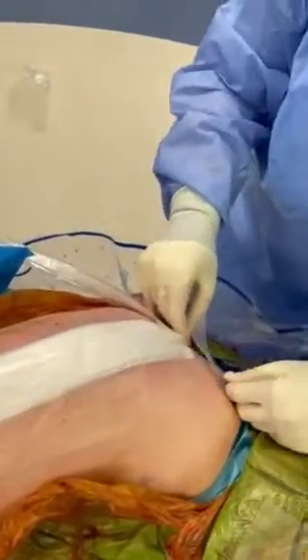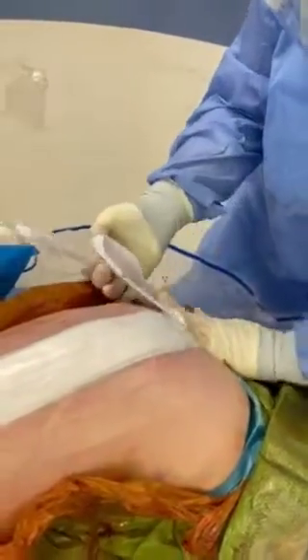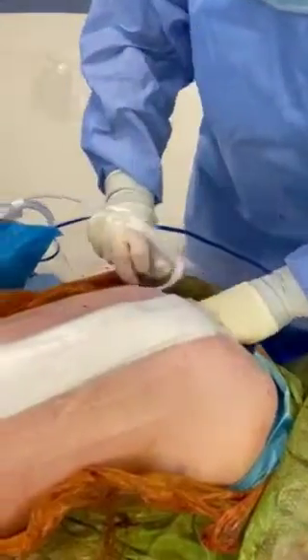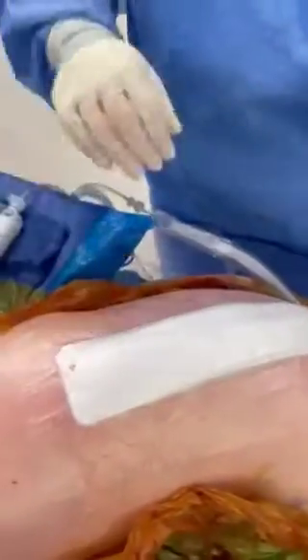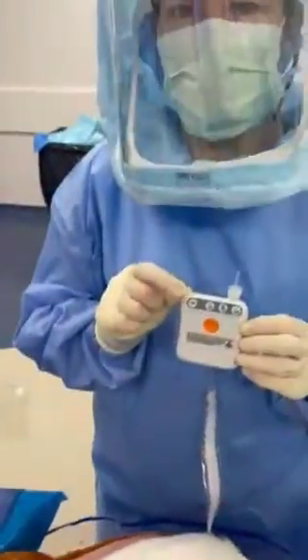And our last one here, put on the end, smooth and pull. And then our last check, you can see it's nice and compressed. Check your little battery pack. We got a green light. Good to go. It's easy as that.